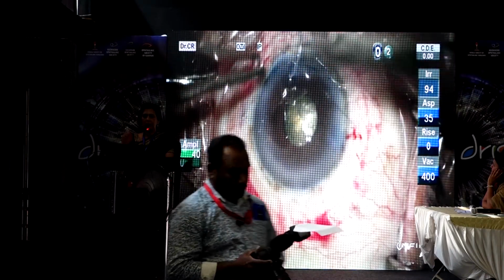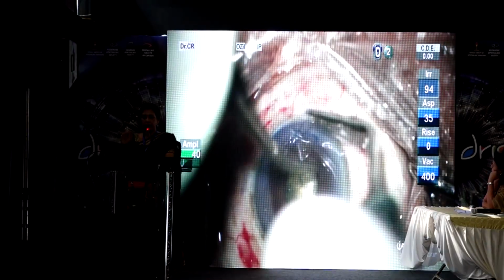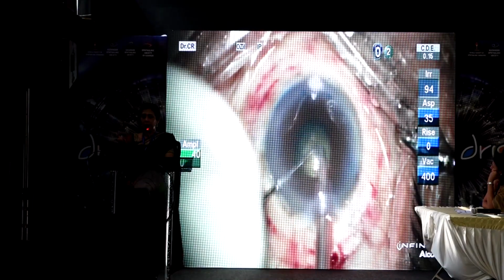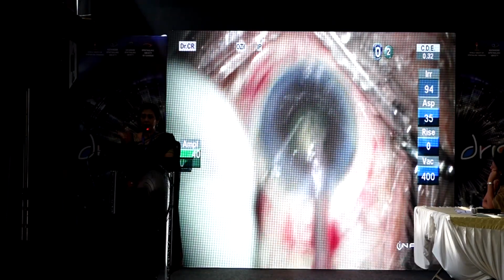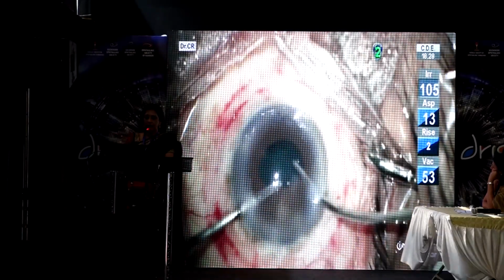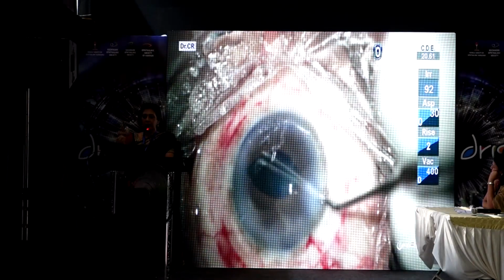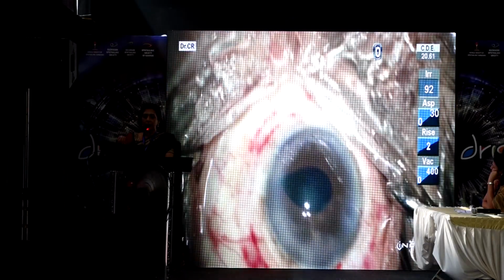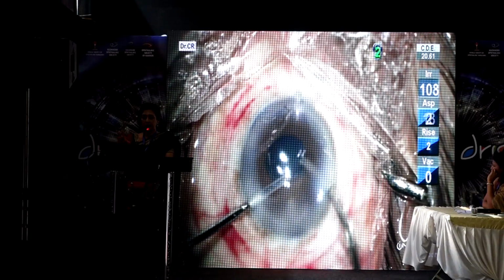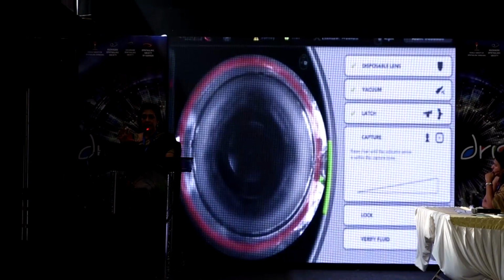It absolutely mandates, it's a very rarest of rare complications, that you need to suture up that small perforated linear incision, because otherwise with a small pupil and a fluid egress, it would become nearly impossible to do an easy surgery. But again, because of the femto dissection and the fragmentation, even with that small pupil and fluid coming out of the perforated wound, we could still complete it as a near routine normal case, and thankfully it did not leave any astigmatic impact. However, a BCL had to be placed.